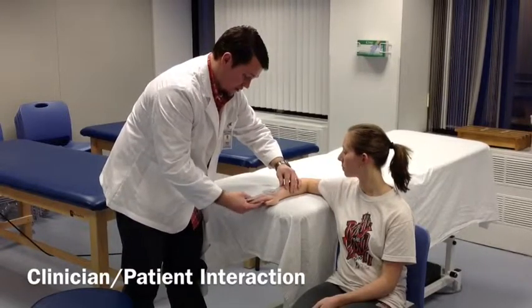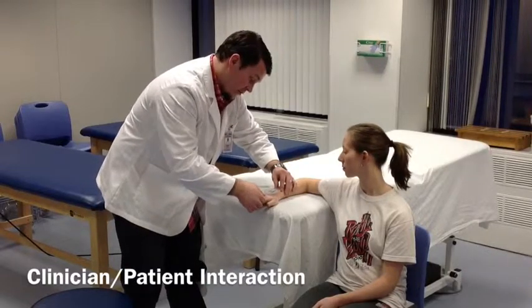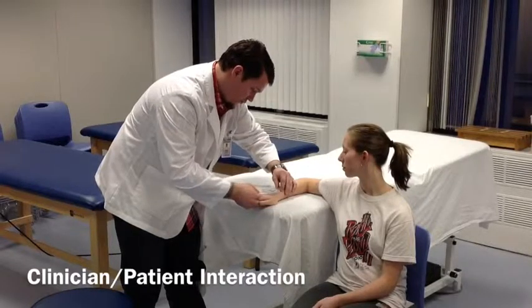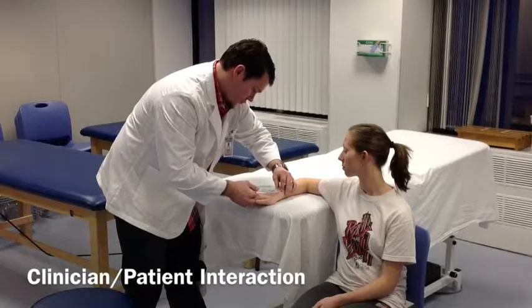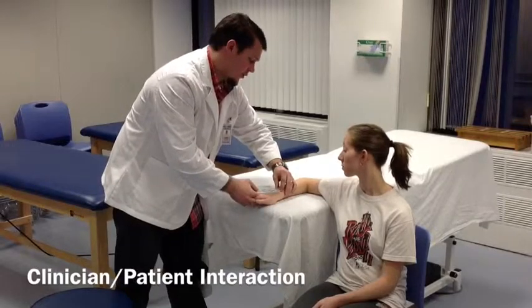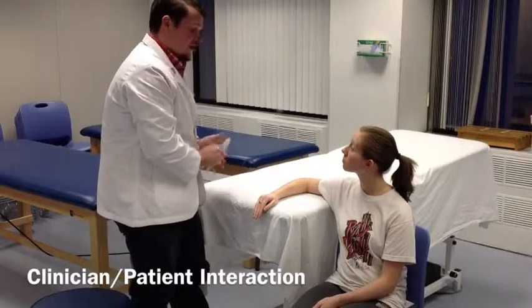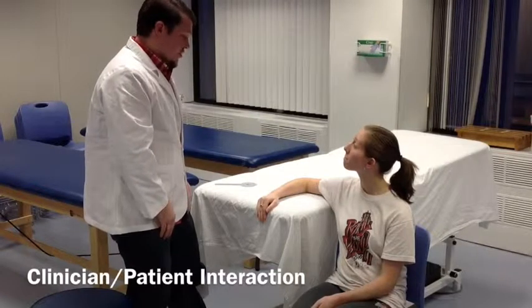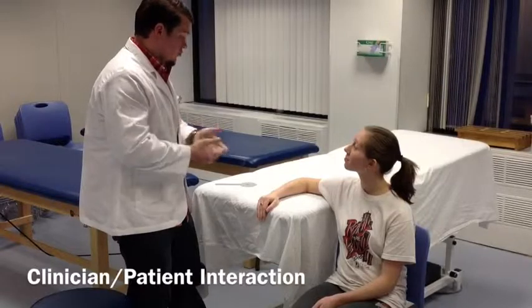Let's go back to neutral. Then just relax your wrist for me, and I'm going to go through the movement myself. Okay, I have about 39, we'll say 40 degrees, which is within the normal standard deviation measurements. So those measurements are pretty similar. It leads me to think that you really don't have any tightness in those structures.